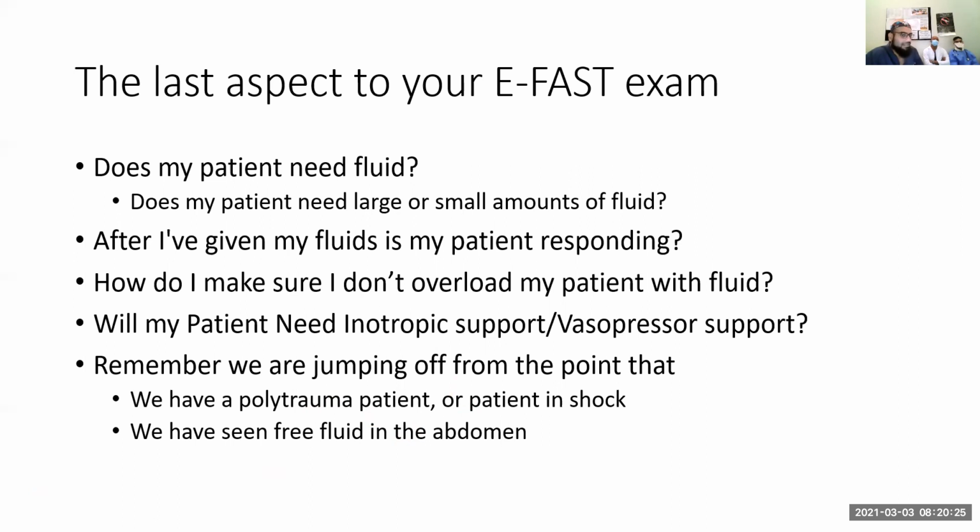Very good, BP. So what determines the BP? Where does your BP come from? What creates blood pressure? Yes, very good, it's the heart. So that should be your first clue. That means you can look physically at the heart as well and see how it's doing. And number two, when you put your BP cuff on, what are you checking? You're checking how quickly your arteries collapse and how quickly they reinflate. So we're using those two aspects, just changing them around a little bit so that we can actually look at the BP in physical time.